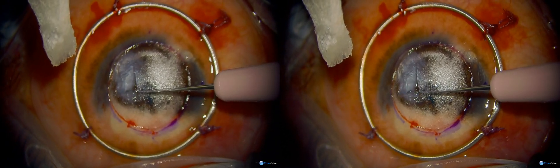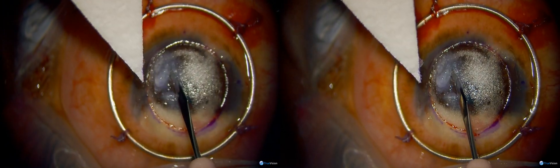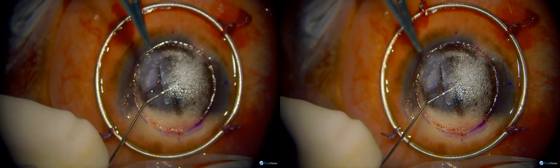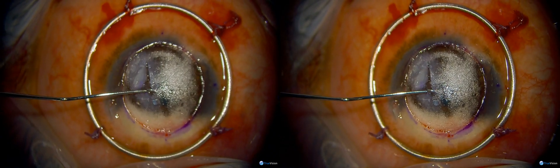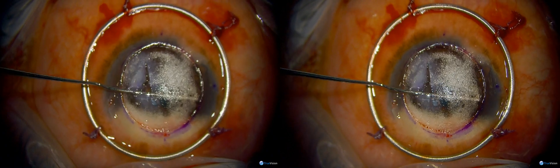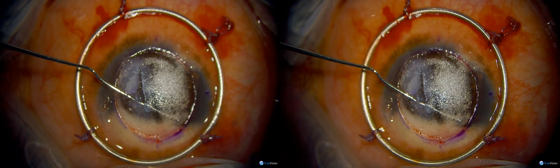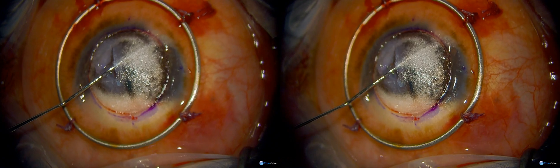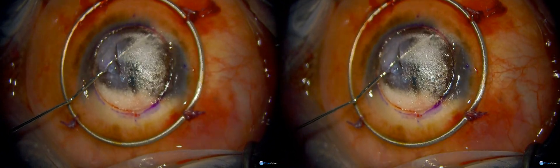She's extending this, and the idea here is to cut this posterior stroma into four quadrants so that you can excise them from the area that was trephinated. Here she's using viscoelastic to fill up that area, and now a dissecting spatula to help extend that dissection into the area of trephination. It's a very nice technique to extend the area of dissection gently so that you can cut it at the area that was trephined, and it's not smaller or uneven at the trephine edge.